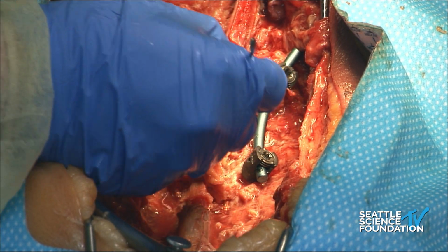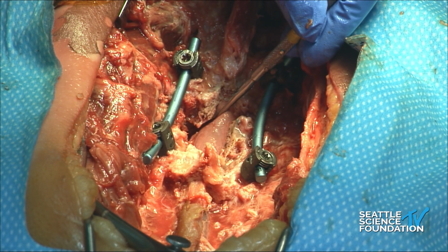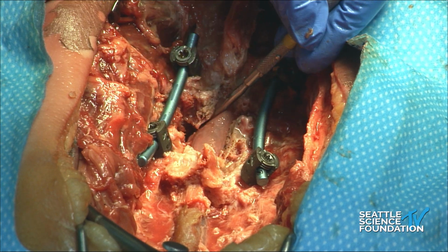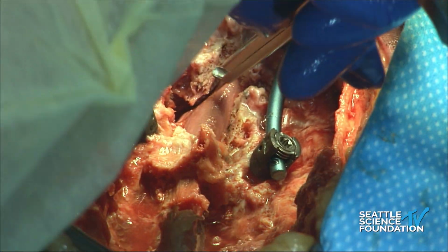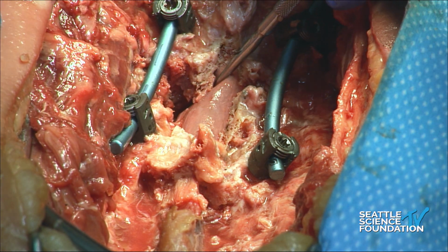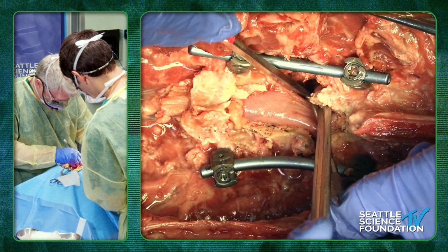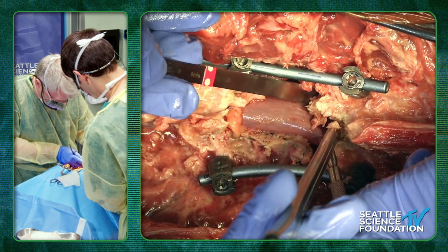So what do you think when you start seeing the dural buckling? Is that an expected thing? Yeah, it's expected. I find one level I don't have problems. On multiple levels I would. So we obviously correlate it with your monitoring. Want to take that out? And then make sure you're decompressed appropriately. Like here, you can see we didn't take the ligamentum flavum on the top here. So that needs to come out.